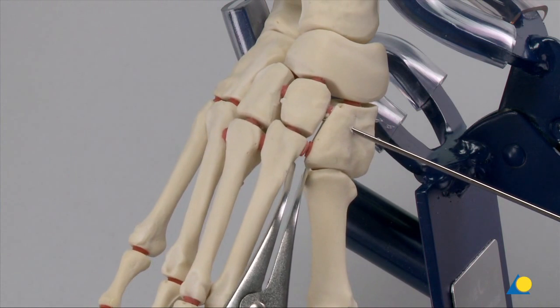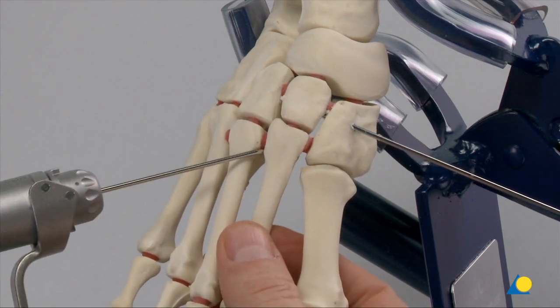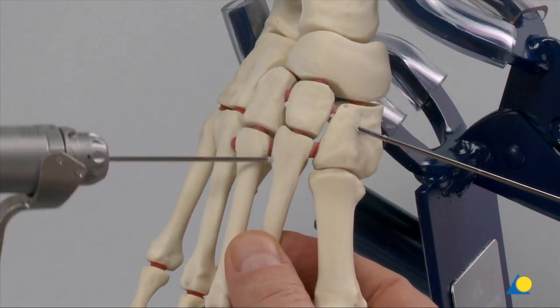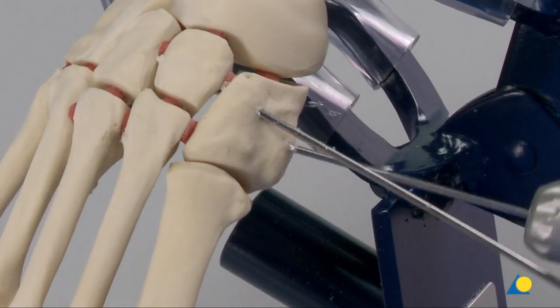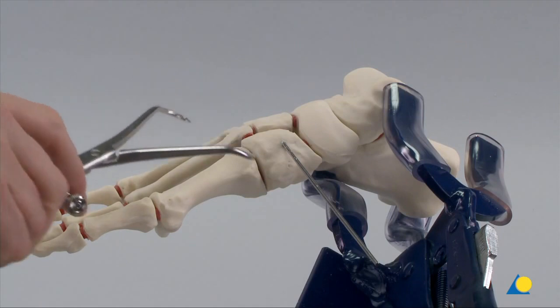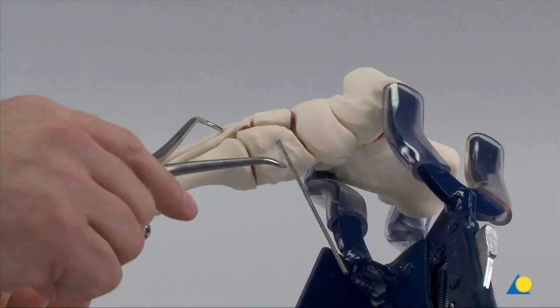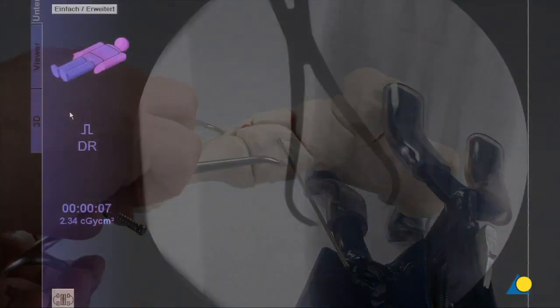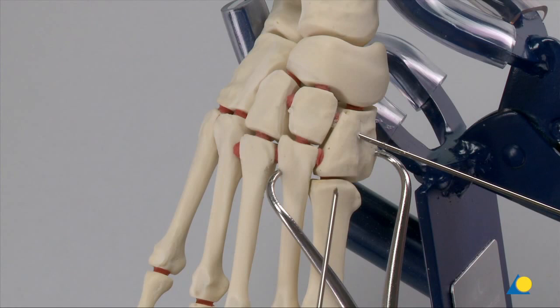The next step is to address the Lisfranc instability. A K-wire is used to create a small conical recess in the cortex to seat the point of the reduction forceps. A second recess is created in the cortex of the medial cuneiform. The large pointed reduction forceps is applied and the Lisfranc injury is reduced by tightening the forceps. The reduction is secured with the ratchet lock. The Lisfranc instability has now been addressed.